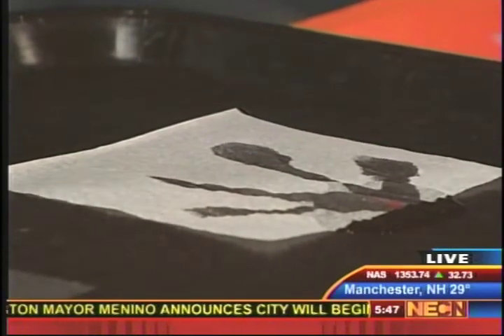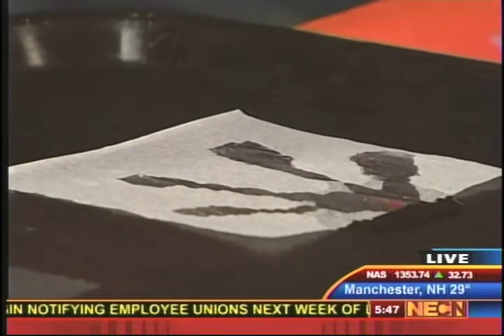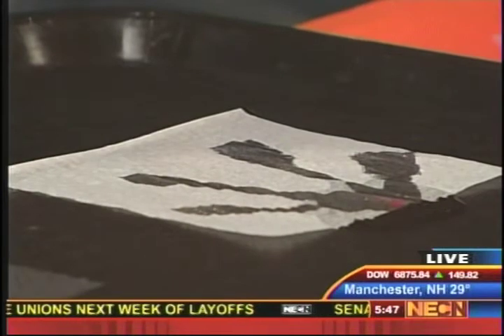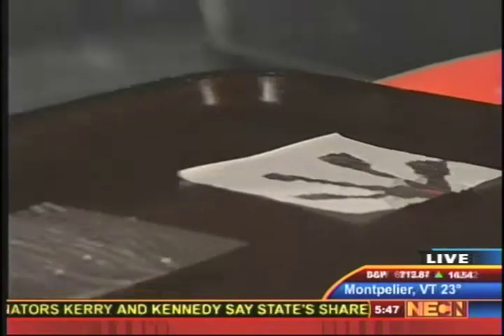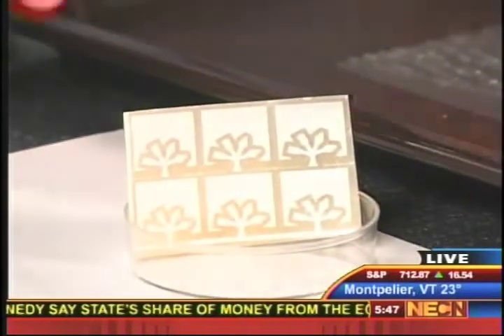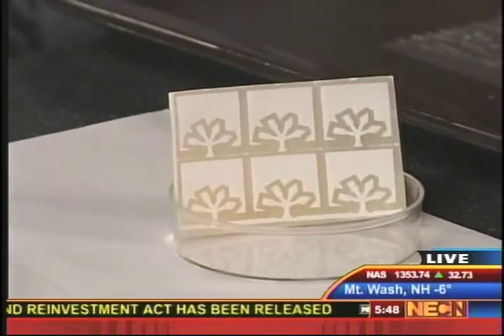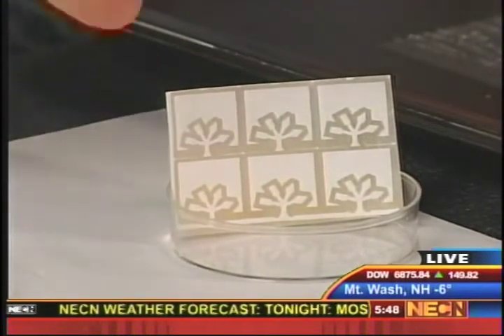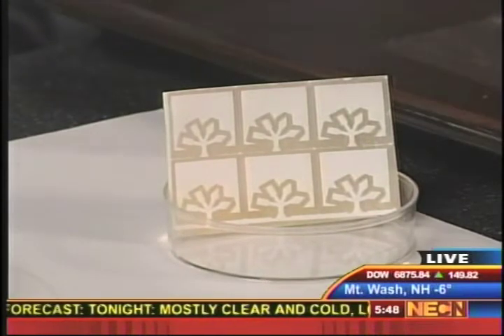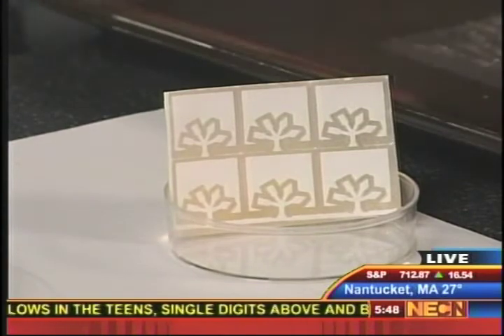So it doesn't take very long, and the results could be almost instantaneous. Excuse me, yeah, that's right, the Harvard researchers. But yeah, they could be almost instantaneous, and you could get a result in a matter of minutes. I've got actually one of their prototype chips right here, and you can see it looks a lot like my bigger version. It's got 4 channels and 4 wells at the top. And in those wells, I put chemicals that react with protein and glucose. So these wells to your left will turn blue-green in the presence of protein, and the wells to the right will turn red in the presence of glucose.